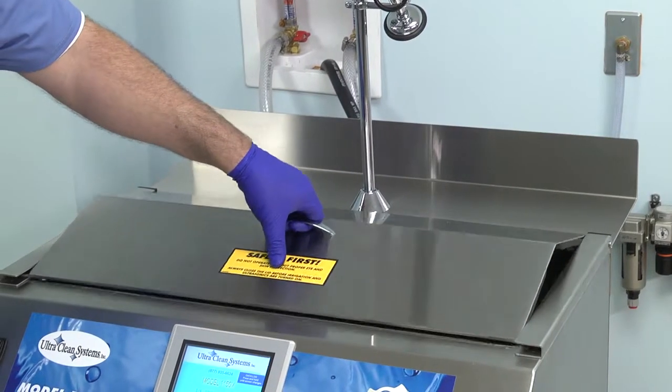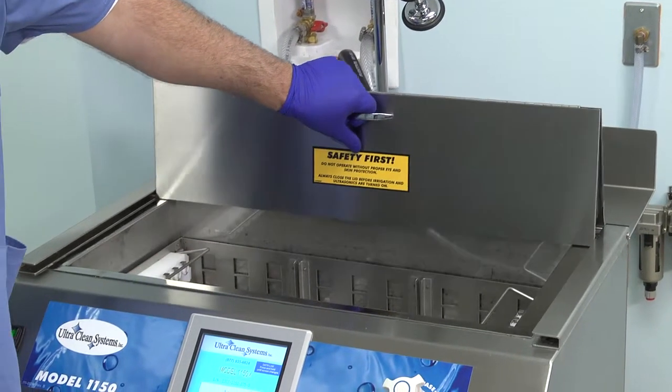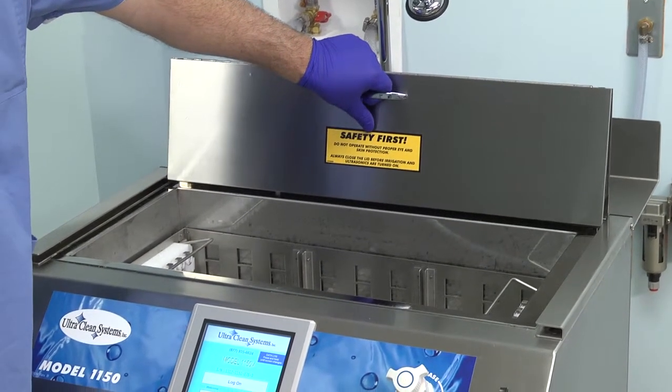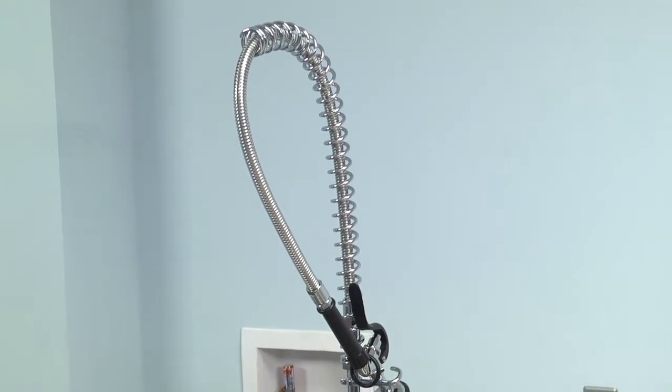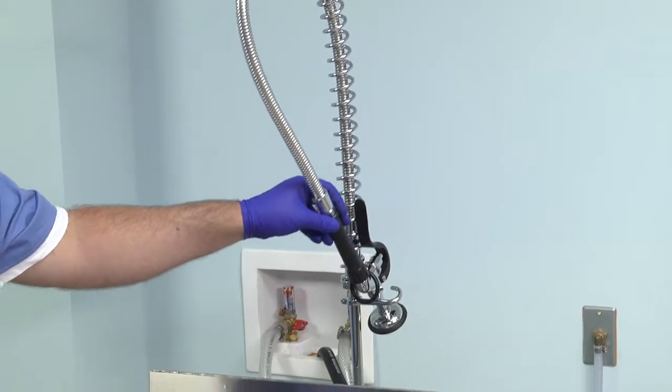To open the lid on the Model 1150, lift the handle up gently until the lid is fully open. Make sure the tabs are in the locked position. For rinsing, a convenient spray nozzle is provided on both models.